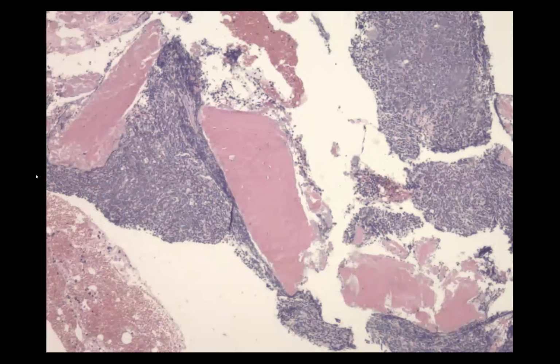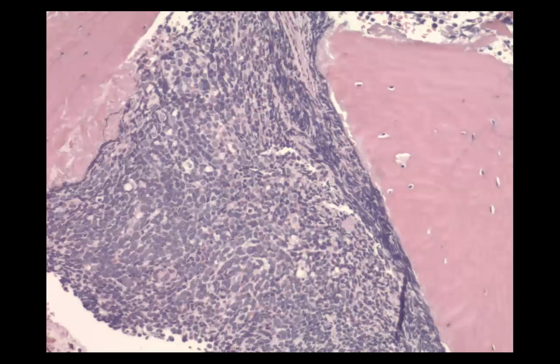So this is from one of the cases. This is a bone marrow where you have the bone spicules here, and it is definitely hypercellular. You see that the cells extend between the bone. You don't see any adipocytes. And the cells are basically the same.